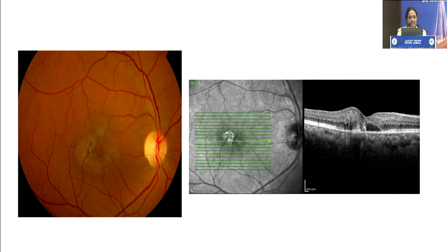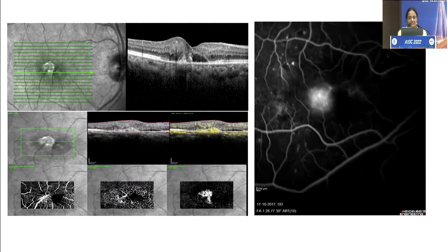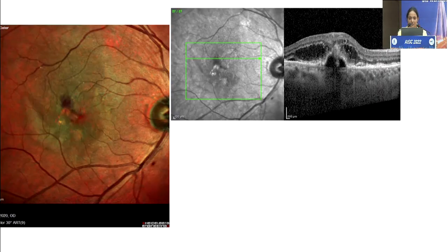So would you believe that this patient has a CNVM? You can see a perifoveal graying. You seem to think that this is just pre-proliferative MacTel. You see this FA, another unholy mess of leakage, masking whatever leakage may be there from a CNV. But look at this image where I've segmented it properly in the subretinal space, and you find this choroidal neovascular membrane.